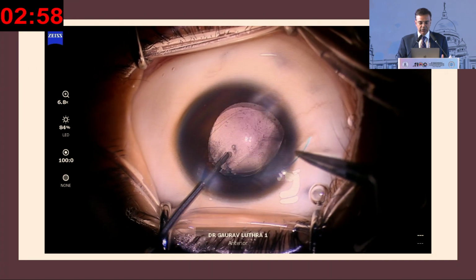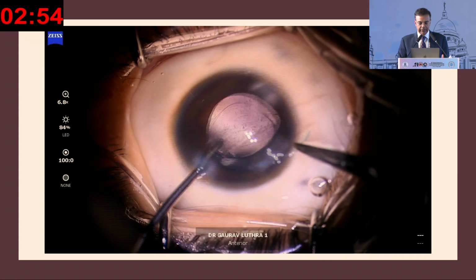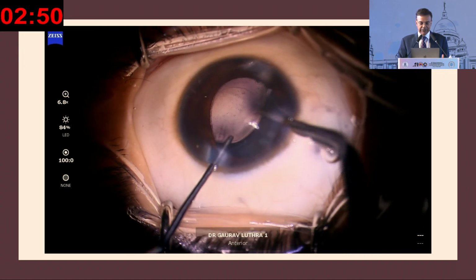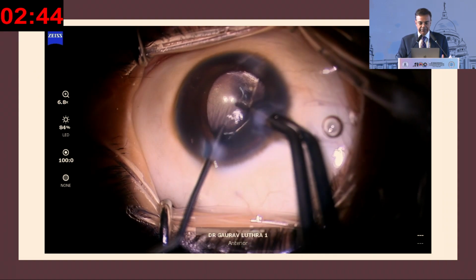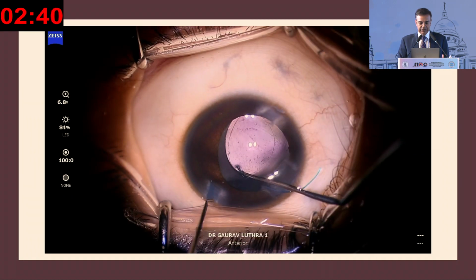So the optic did go in after a bit of coercion, and now I want to put the second haptic. You can realize that the bag seems a little too small because the optic went in with difficulty. I'm trying to put the second haptic into the bag, but it's not going very easily. There's manipulation and it tends to just pop out.